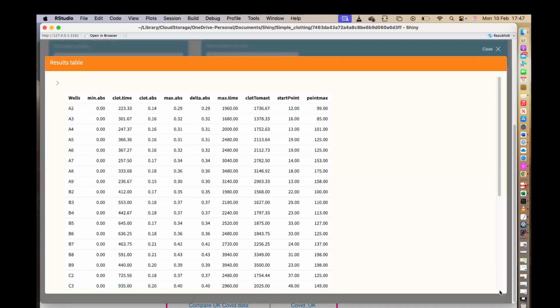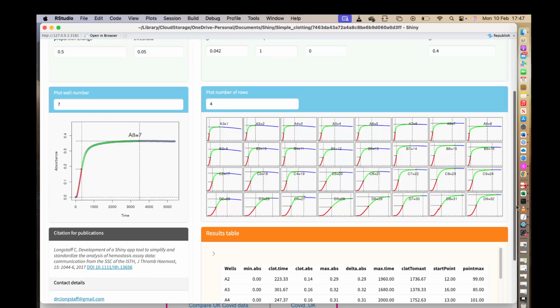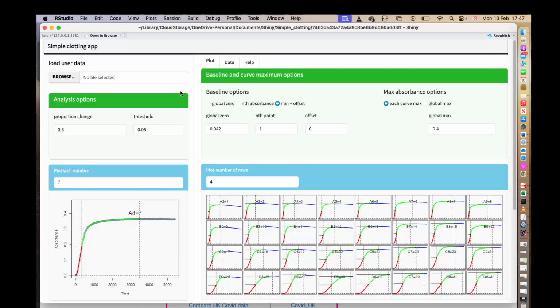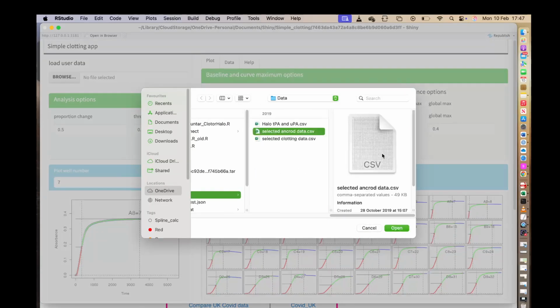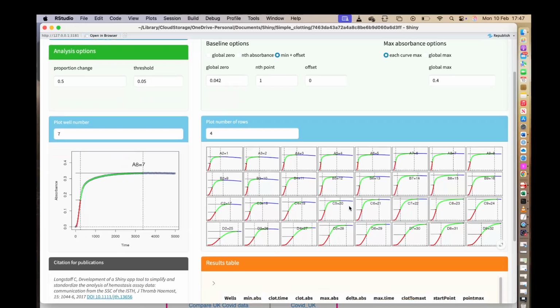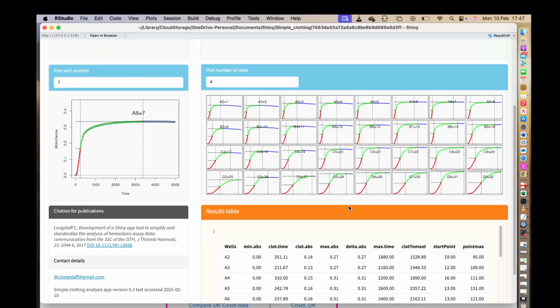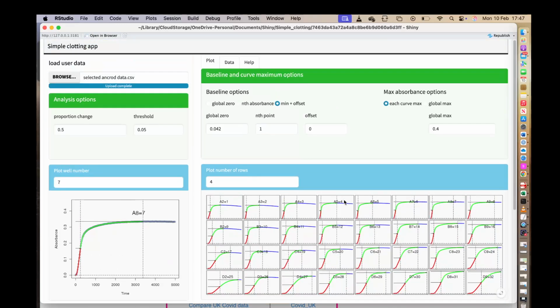When you have explored the data provided with the app and are comfortable with the available settings, you can begin to analyze your own data. This is selected using the Browse button in the top left corner. From here you should navigate to your CSV, text or Excel file of data and open it in the app. The file type is automatically detected. If you are using Excel files, you can specify a sheet number where your data are.